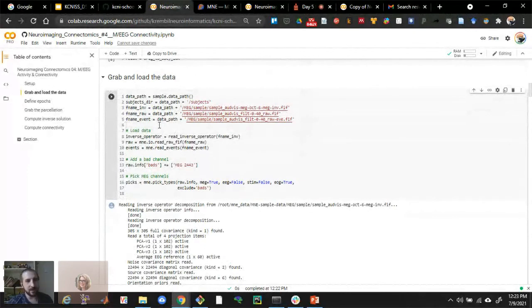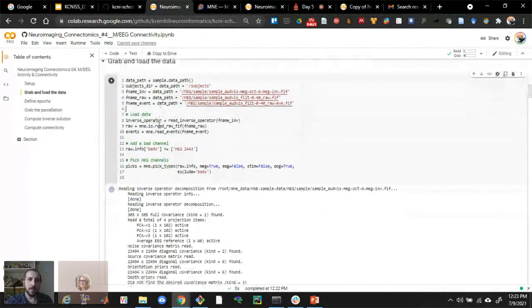Now, with EEG and MEG, our starting point is channel data. Extracranial channels on the scalp for EEG, or slightly above the head for MEG. What we want to do, not all the time, but particularly for the things we want to do, is estimate what we call neural activity in what we call source space.